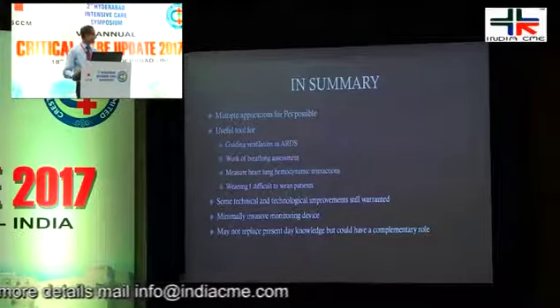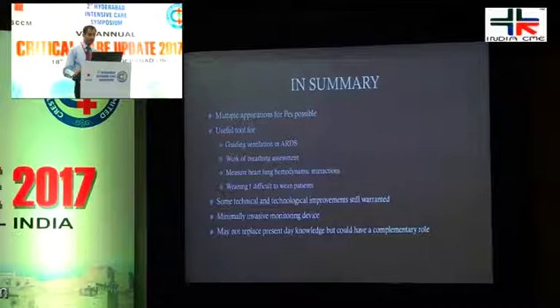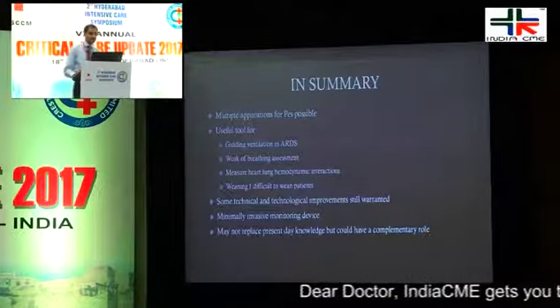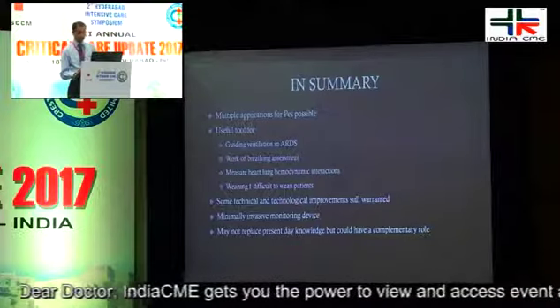There are some technical and technological glitches which are still present in the current generation systems and probably need better technology. But the most important thing, it's a minimally invasive device and may play a complementary role in our current clinical practice.